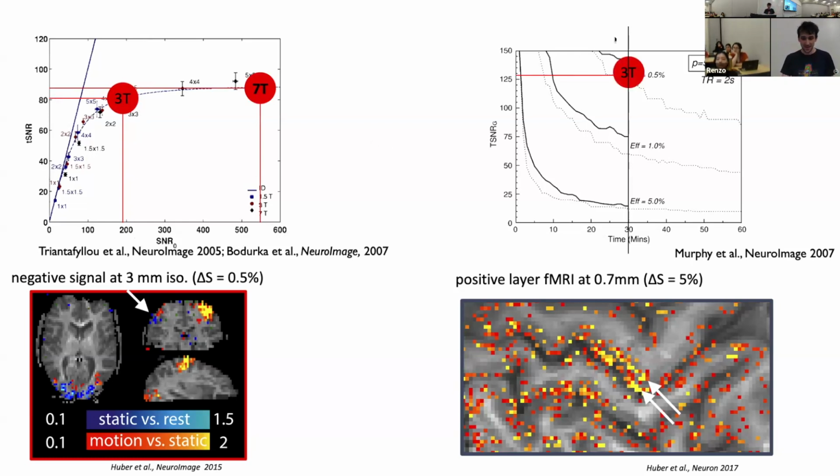And this means that even though we have pretty good sensitivity, because of our small effect size, with this increase in stability that's pretty small, we even have a smaller benefit in minimum scan time needed. So we maybe increase the necessary scan time from 30 minutes to 28 minutes or numbers like that.